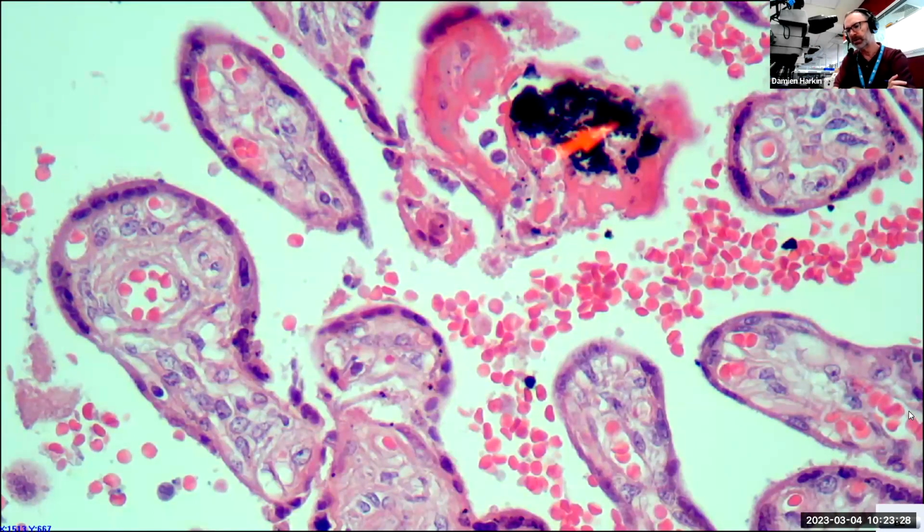But bear in mind there are clinical scenarios where you can come across this. I was talking to a colleague briefly this week about it, and he mentioned it's not uncommon with whole lung biopsies, in the case of failed transplants, where you can come across formalin pigment more often than in other situations. I imagine that's due to the local histochemistry within lung tissue.